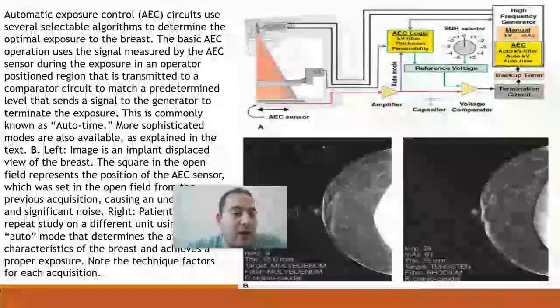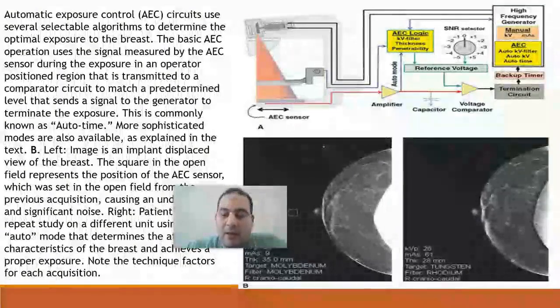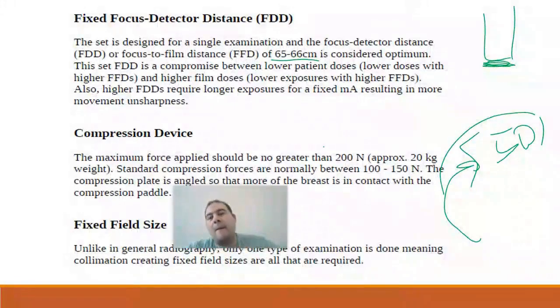As I said, the system provides pre-exposure to determine and assess the attenuation that has occurred and begins to make pre-adjustments to these parameters. Doctor, can you confirm this? The pre-exposure is what develops the pre-adjustment. Yes, but could you clarify this point?